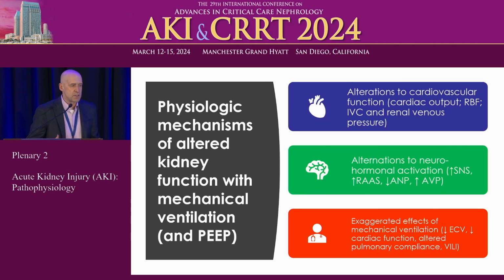So at a high level, there are key physiologic mechanisms that alter kidney function with mechanical ventilation, and particularly the application of positive pressure ventilation and PEEP. These include alterations to cardiovascular function, cardiac output, renal blood flow, IVC and renal venous pressure, systemic venous pressure. Dovetails nicely with the end of Andy's presentation. Alterations to neurohormonal activation, including sympathetic, renin, angiotensin, aldosterone, natriuretic peptides, and arginine vasopressin.